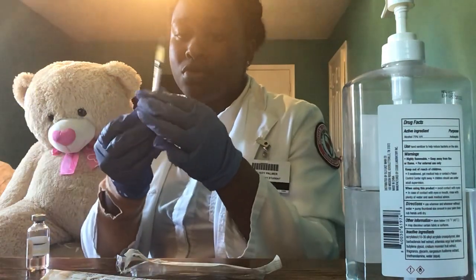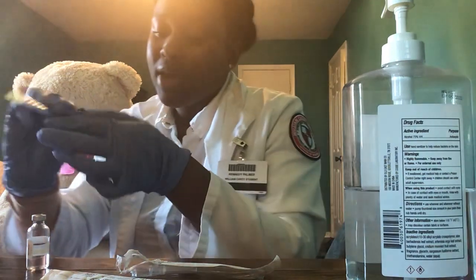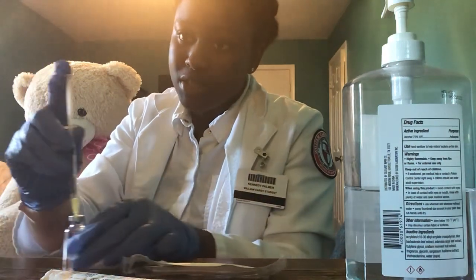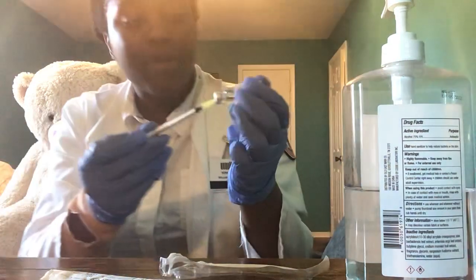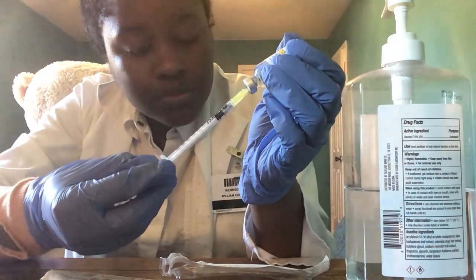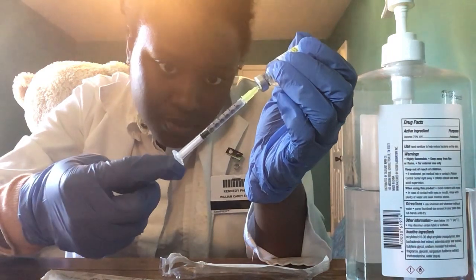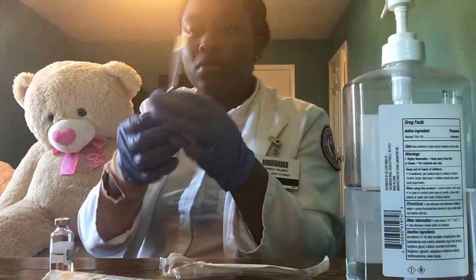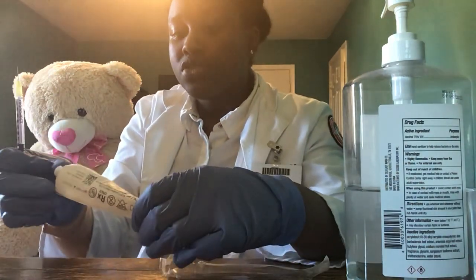Okay. I'm going to draw up 0.8 milliliters of air. And now I'm going to inject that air into the medication. And now I'm drawing the medication up. Making sure there's no air bubbles. I'm just going to remove the air bubbles.